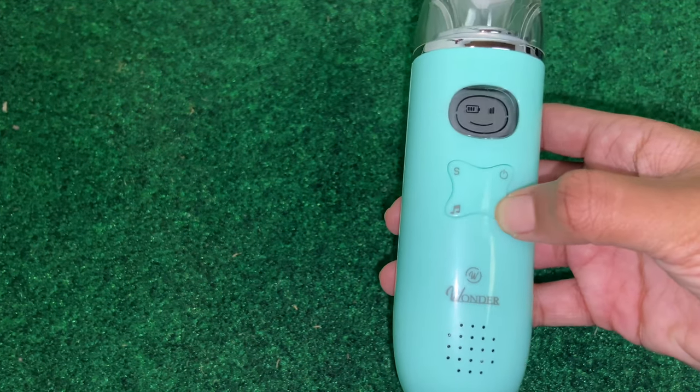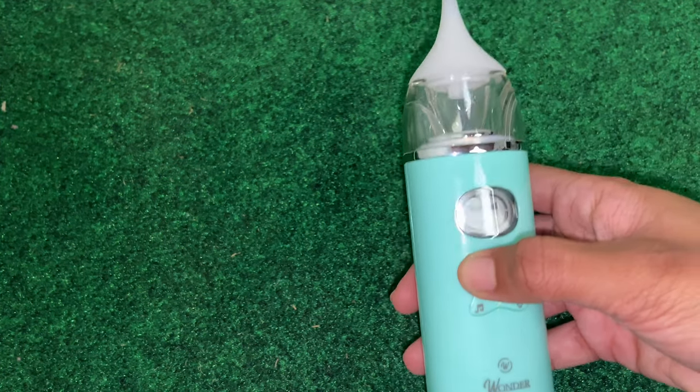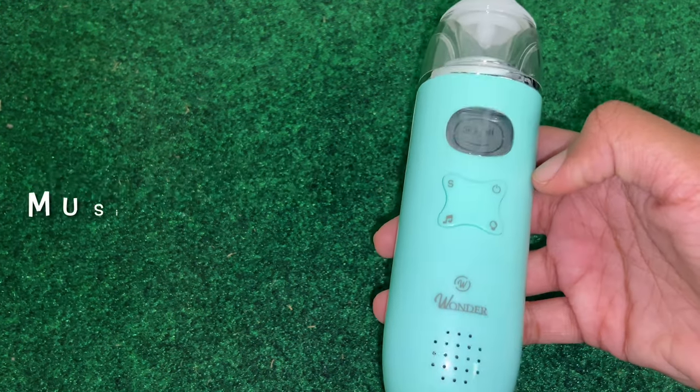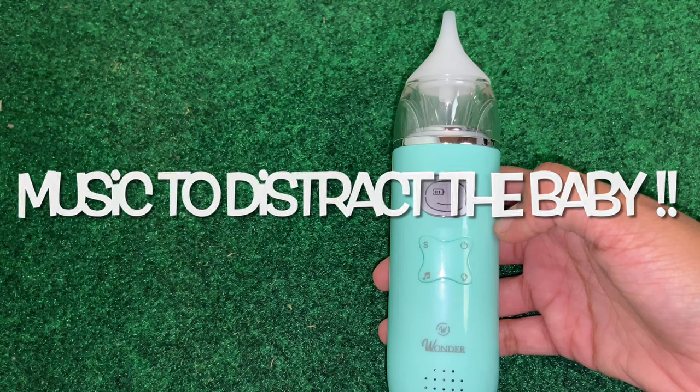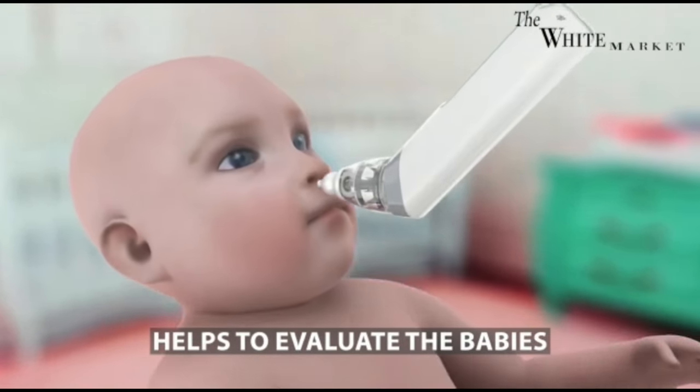To turn our device on, we simply click that on button and it displays the battery life. Next, when you click that light bulb button it adjusts the intensity. The S stands for suction, which is what you will use to clean the baby's nose.